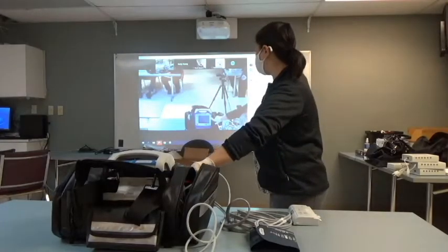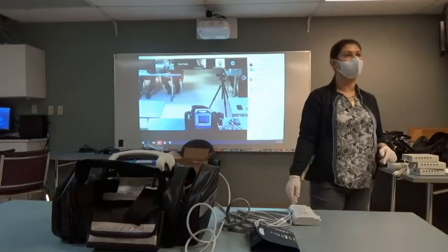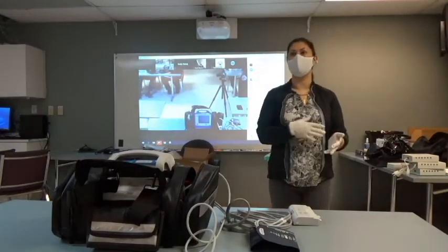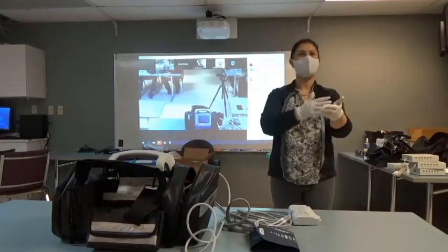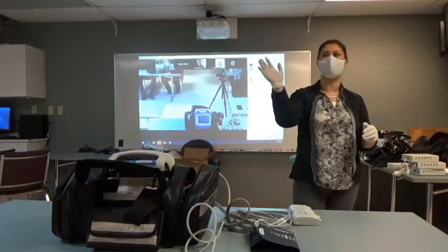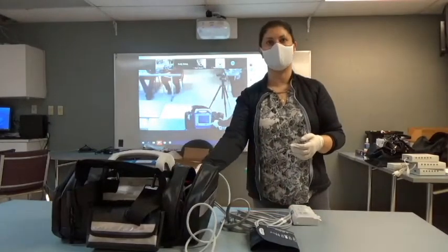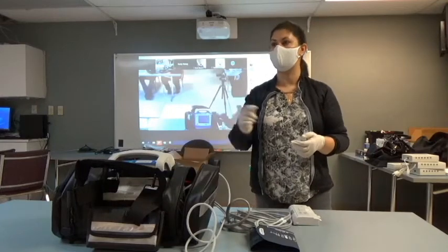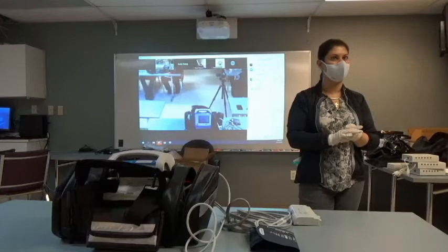On the opposite side of the device, those buttons don't have any pictures. We're going to think of these as apps on our phone. If you have smartphones, I'm sure you have multiple apps on your phone and you can scroll through the different pages. This has a little back arrow or boomerang key that allows you to scroll through the different apps. I'm going to refer to these as the apps on my phone, because whatever the icon is, that's the button push or the app we'll get into when we turn this on.